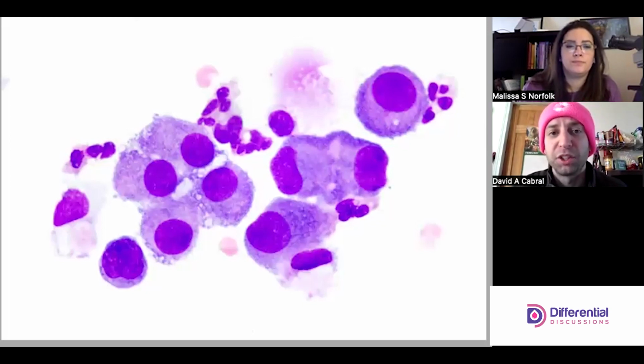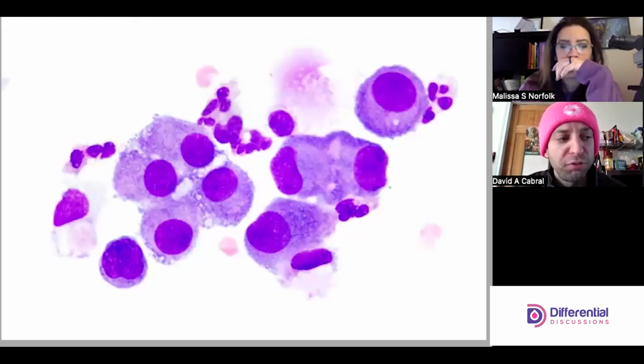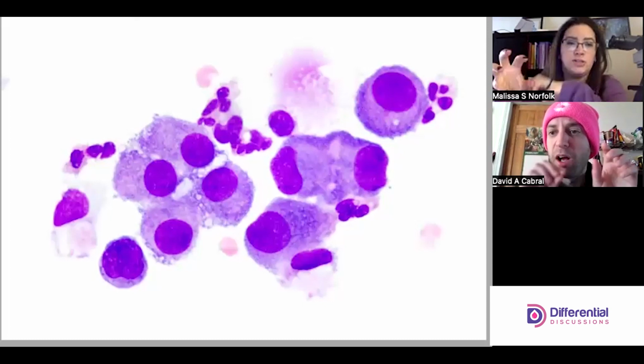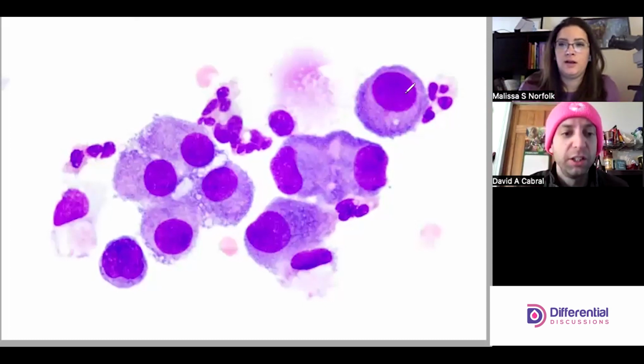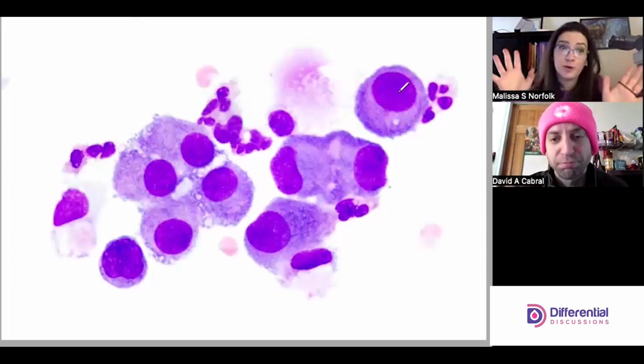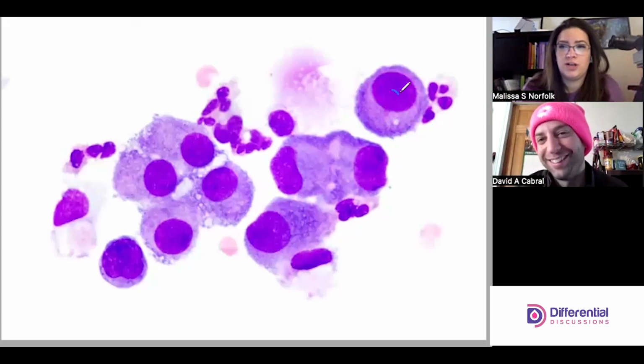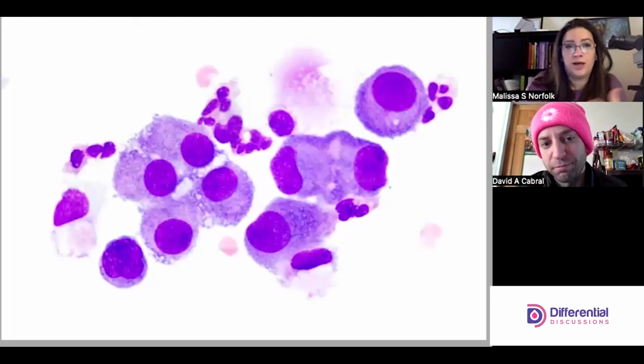So plasma cells frequently have a pattern similar to a CLL lymph, like a soccer ball, with white striations. The textbook plasma cell, which you almost never see, will show you white striations radiating out from the nucleus all throughout. That's the typical plasmacytoid nuclei chromatin pattern we'd be looking for. And this one's nothing. Totally absent.